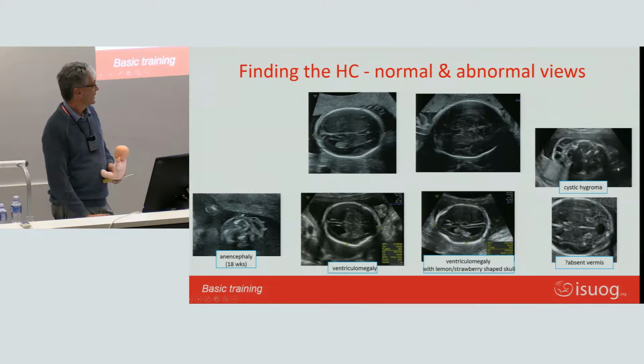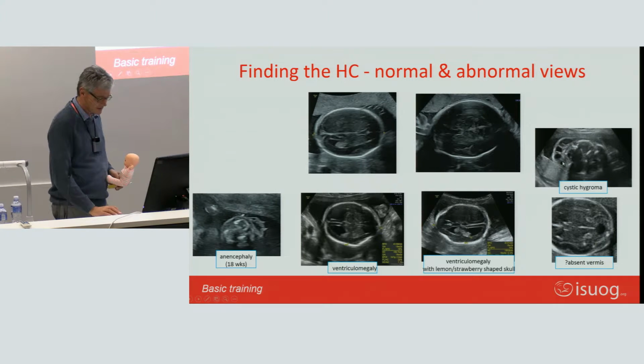Going lower down in the neck, we see those pockets of fluid that we referred to in the first trimester as well, the cystic hygromas.